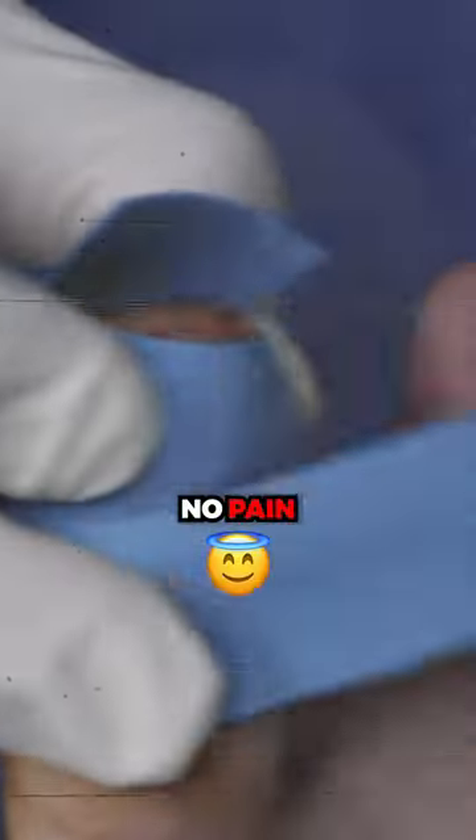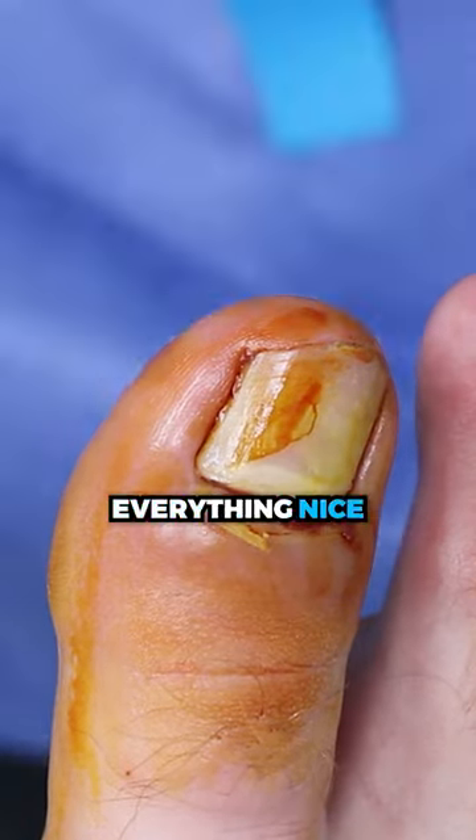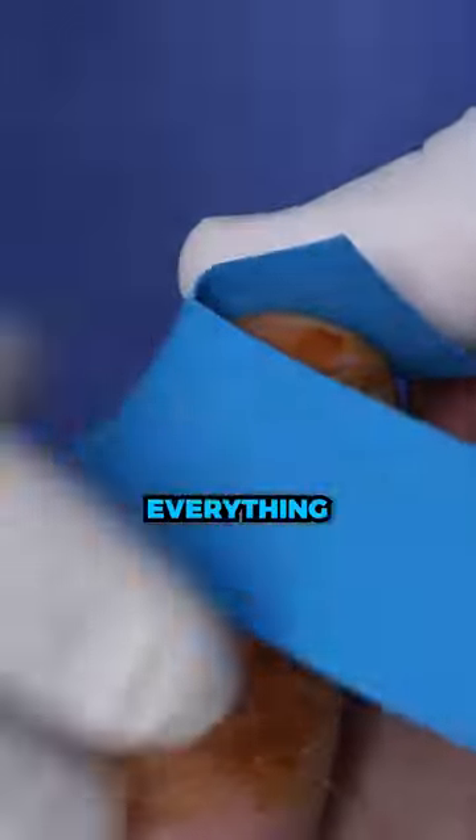What's very important: no pain, pinching is completely normal. So we're gonna put on a rubber band — this is a tourniquet — so there's no blood and I can see everything nice and clearly. This way we make sure we clean everything up really nice.